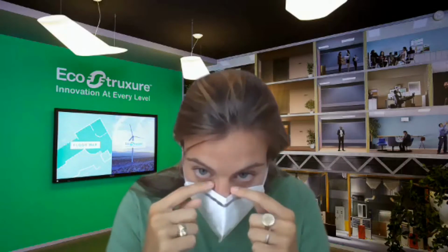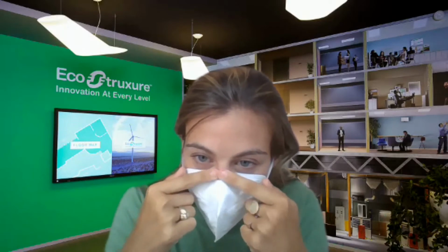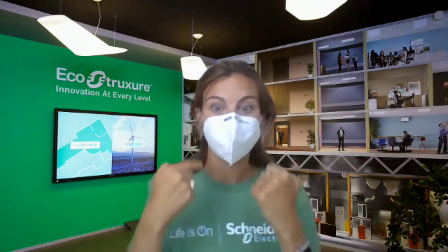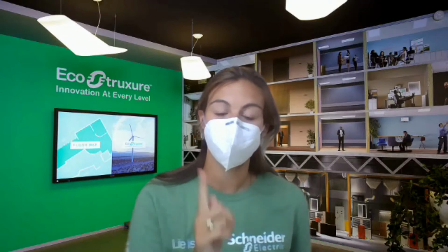Now, if you see this gap at the top of my mask, I can fit this to my face by pinching the metal piece across the bridge of my nose, effectively sealing it off at the top and ultimately capturing any expelled droplets, making sure that others can't get within mine. I want to make sure that I keep my hands off my face for the remainder of the day. This is my only mask for 5 days, unless soiled, at which point I need to immediately go get a replacement.